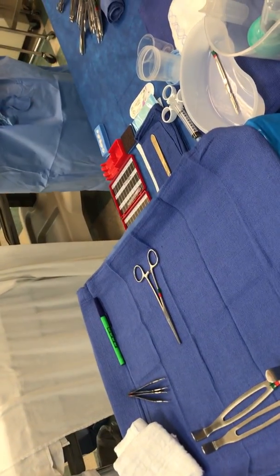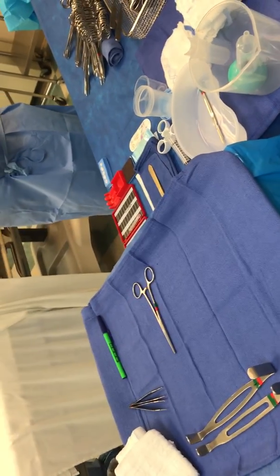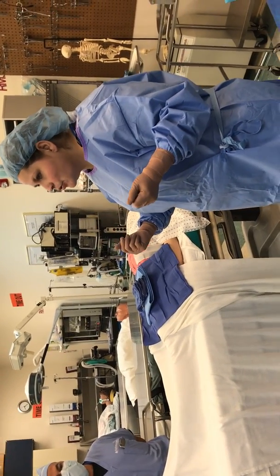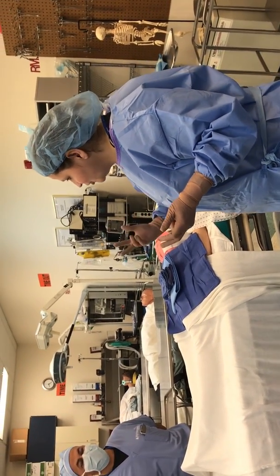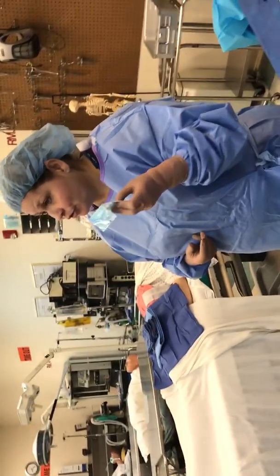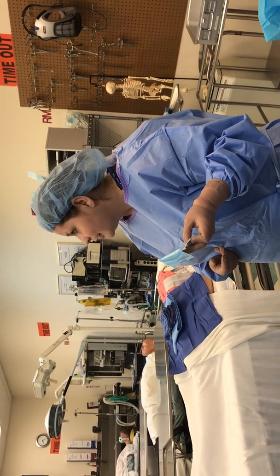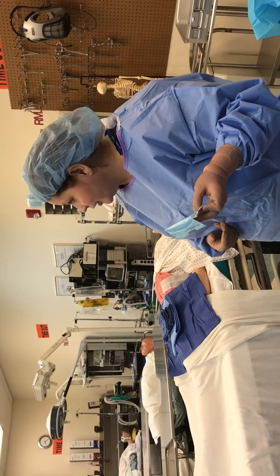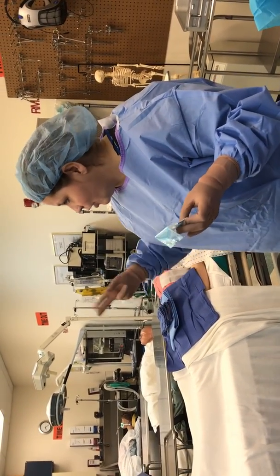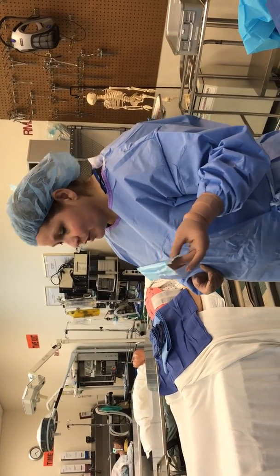They might need to dissect. That's why you need the tonsil. The Alice, what is the Kelly for? Clamp. If they come into a blood vessel and it starts bleeding, they need to clamp that vessel. You wanna clamp. When they clamp, what do you need? A tie. When you have a tie, what do you need? Scissors to cut, right? And usually they tie, clamp, and then they do it again, because it's one end. There's 2 ends to each vessel, right? So you're gonna need 2 ties.